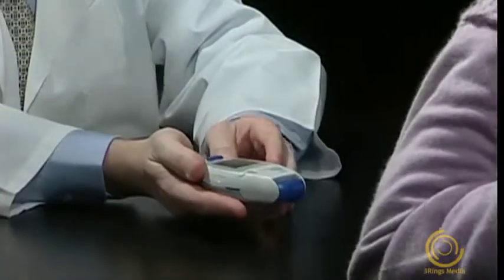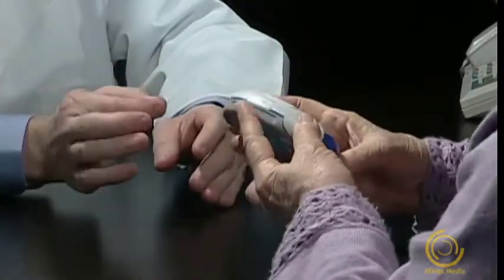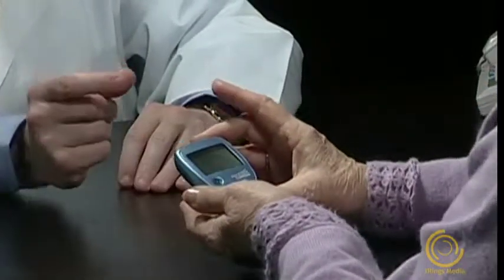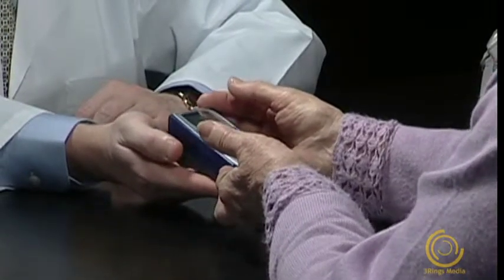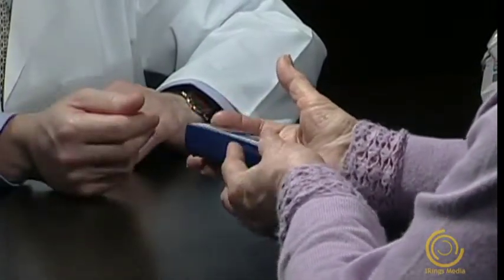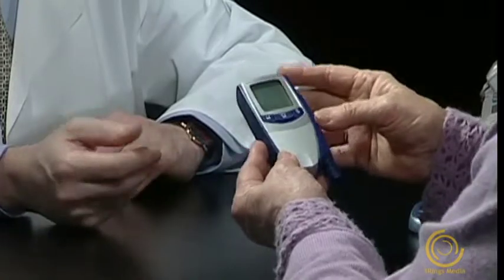Where do we start? Mrs. Jackson, there are three meters I'm going to suggest for you. The first one is the Breeze — it requires no coding, has a large display, and there's no strip handling because there's a disc with 10 test strips. The second is the Contour, which requires no calibration, but the strips are a little small. And finally, the Compact Plus codes itself automatically when you insert the drum, has a large display, strips come 17 in a drum, and the lancing device is detachable.